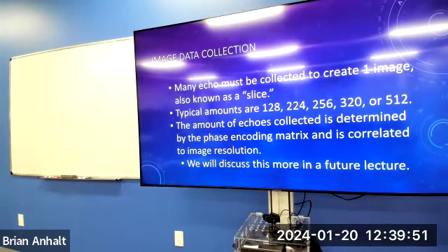This is going to go outside this really quick, but this is just a good point to talk about data collection and something called multi-slice acquisition. Not going to have too much on the quiz about this. It's going to be mostly contrast and stuff we learned before, but there's a reason this is in here now. You'll understand later.